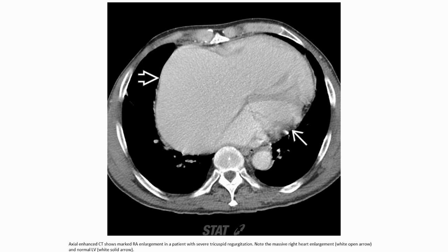Axial CT demonstrates right atrial enlargement in a patient with severe tricuspid regurgitation. Note the massive right atrial enlargement indicated by the wide open arrow, and the enlarged right ventricle indicated by the wide solid arrow.